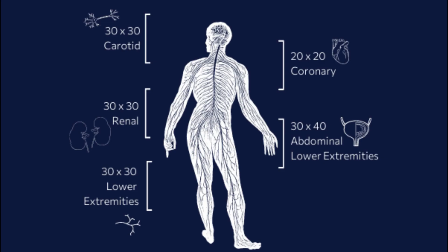How to pick the size of a cath lab detector? You should choose the detector size based on the type of work you will perform with the system. Most cath labs with smaller detectors, 20 centimeters, are preferred for cardiac and pure neurological procedures. 30 centimeter detectors are considered a combo and can perform both cardio and vascular studies.